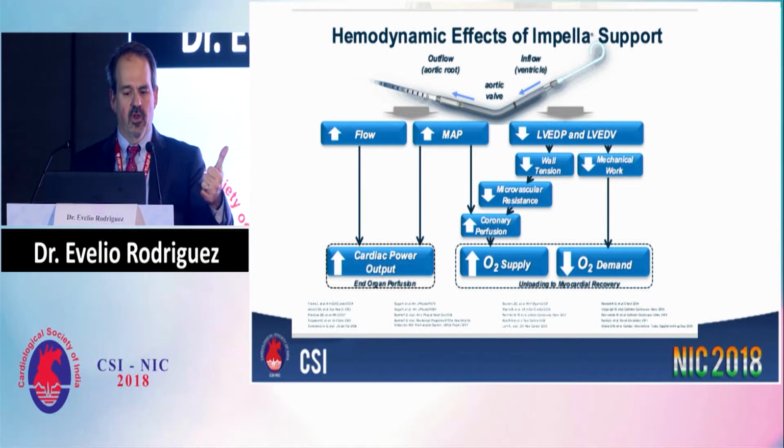It increases flow, it increases mean arterial pressure, and it decreases left ventricular end-diastolic pressures and end-diastolic volume, which results in increase in cardiac power output, which helps for end organ perfusion, increases oxygen supply, and decreases oxygen demand. So you get all benefits from support.